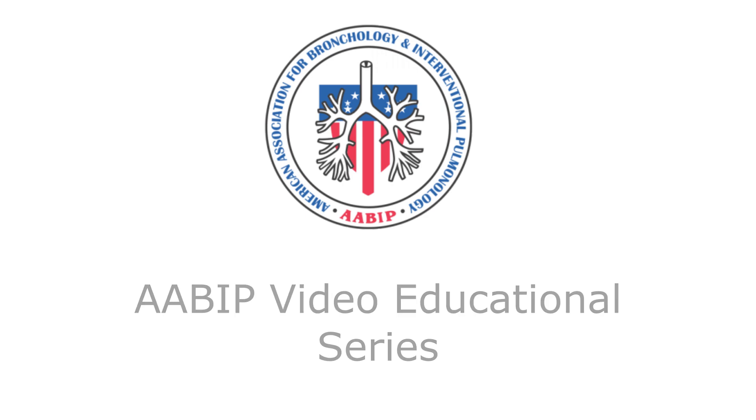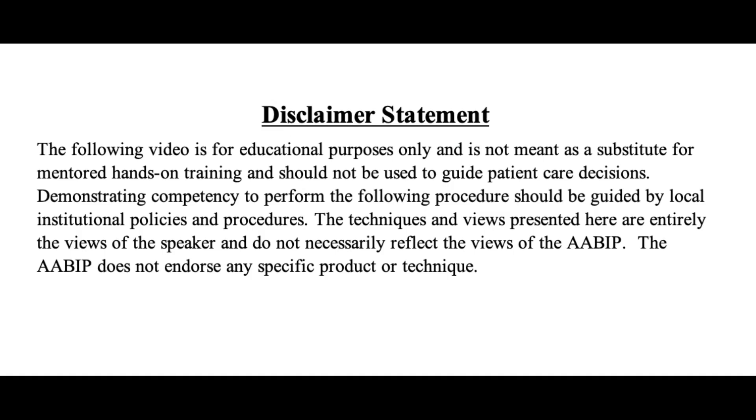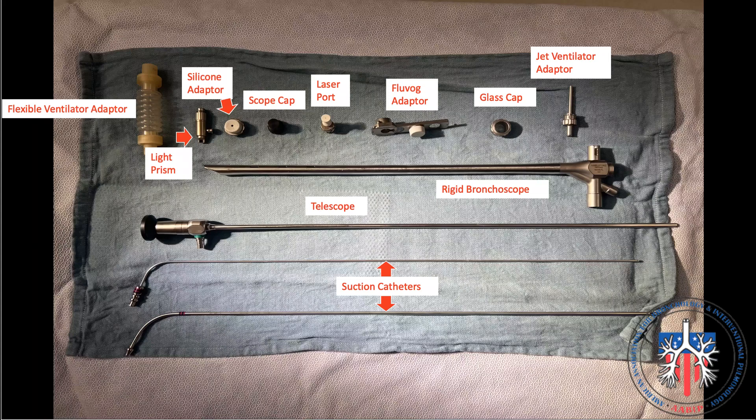In this video, we will demonstrate how to assemble CarStor's rigid bronchoscope. As you see here, there are many different parts including adapters for conventional ventilation and jet ventilation, ports and caps which provide flexibility in using different tools. For practical reasons, we will only demonstrate essential parts that are necessary for the Storz rigid scope to be functional.